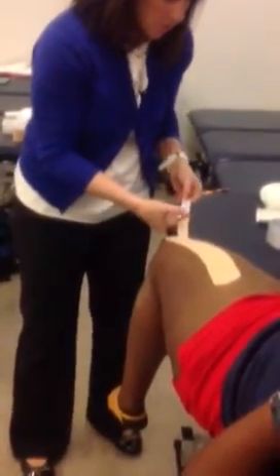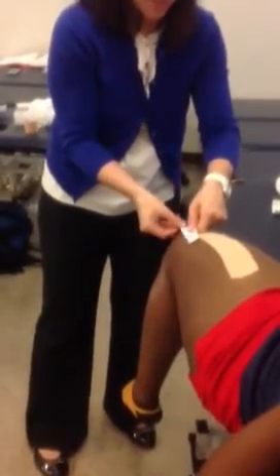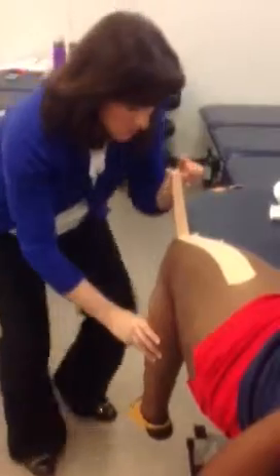So this is the hardest part, honestly, of doing the patella stuff, because when the knee is bent, the patella moves all around. So sometimes it's easier to make a circle so you know exactly where your patella is until you get really good at doing this — and still I find sometimes I rip it off and start over.